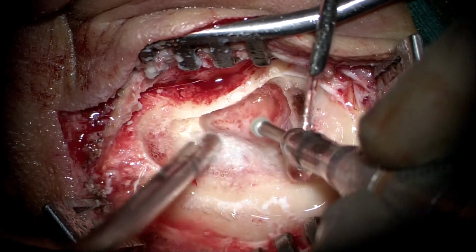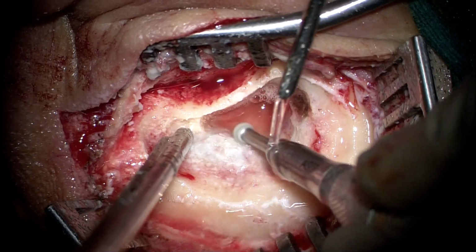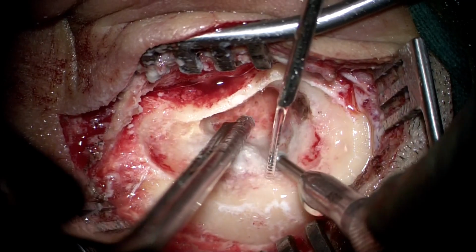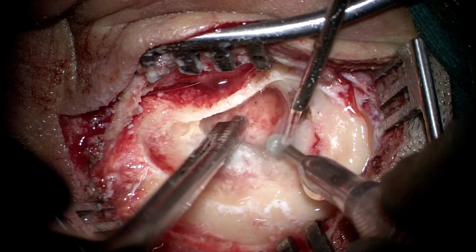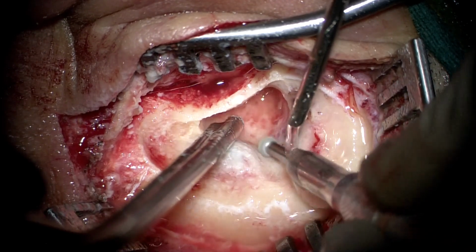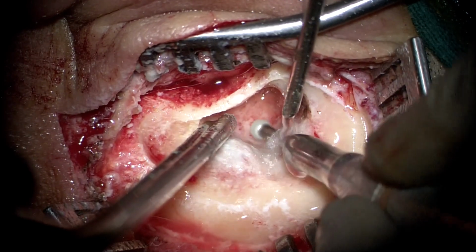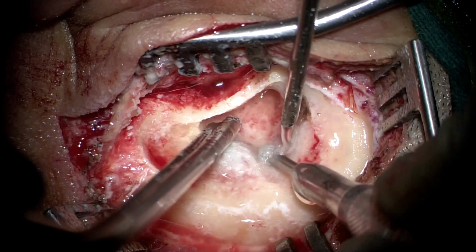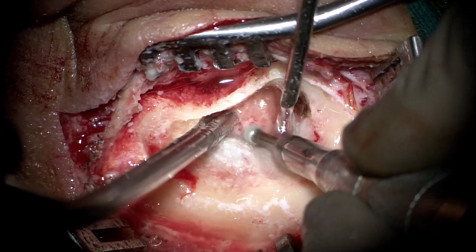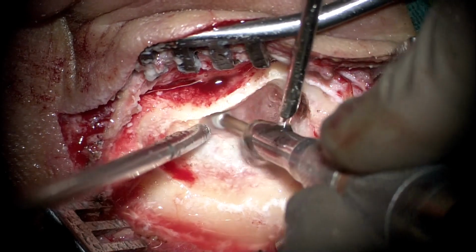And this is also important because the ampulated end of the posterior semicircular canal goes inferiorly medial to the vertical segment of facial nerve. So that part of the mastoid has to be exposed completely for us to be drilling the posterior ampulla very, very clearly. The process of sigmoid sinus unroofing should be known to all otologists, because these situations can arise very often, whether it is a labyrinthectomy, whether it's a cochlear implant surgery in a markedly sclerosed mastoid.